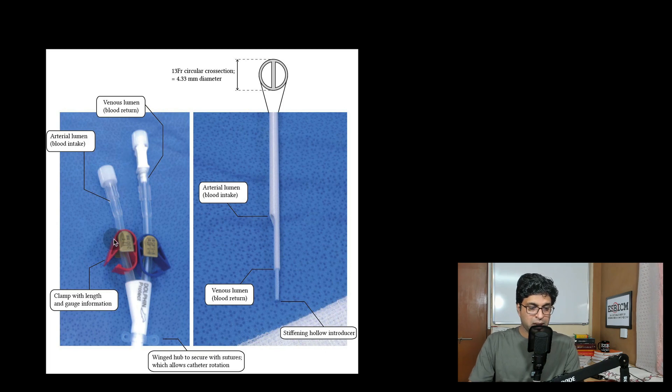So now, here is your dialysis catheter. You can see this is the red port, this is the arterial lumen, means blood we are taking from the body towards the dialysis machine, then here it gets filtered and then it comes back to the return port, means the blue port.